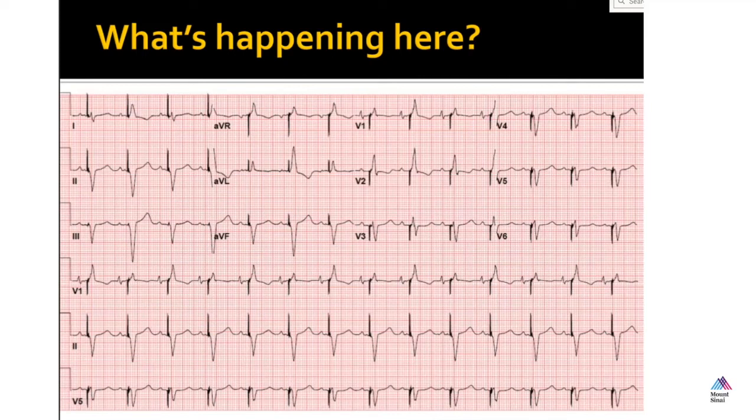Yeah, that's the uncomfortable part. So you're right. The first thing you would do if you saw this would be to extend out the AV time as much as possible to see if you could get, right, I think if we could have a PR of 200, but it was 100% A-sense V-sense rather than A-sense V-pace, that probably is preferable. It would be interesting to see if this patient had an A-line in place, if one of these complexes actually was better than the other in terms of blood pressure and stuff. So it's a good point you made. Thank you.